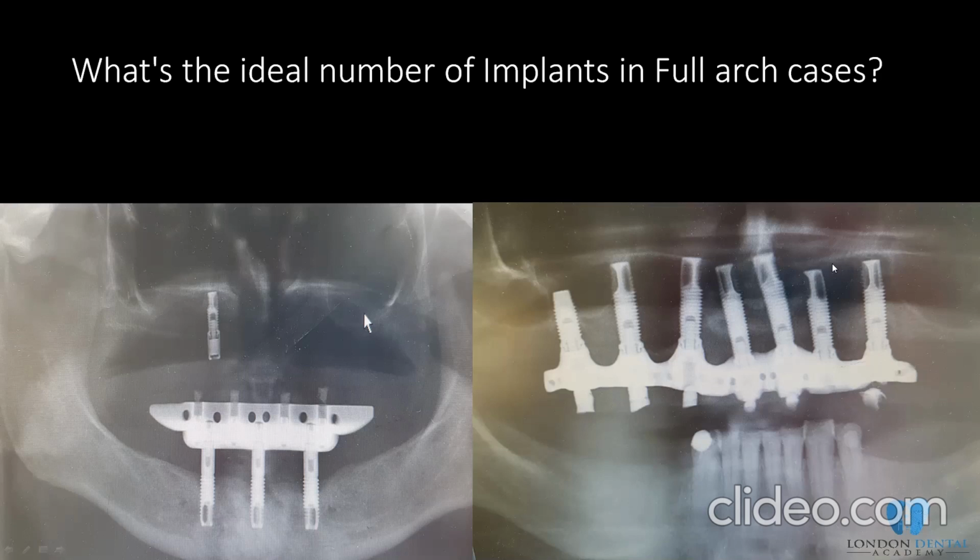Do you take impressions on the multi-units? Yes, I do, but I don't do it here. We're talking about implant overdentures. In some cases, we need to use bars or splint implants.